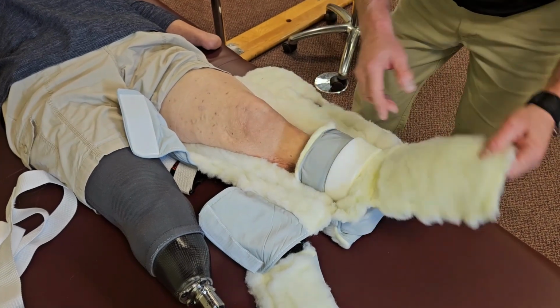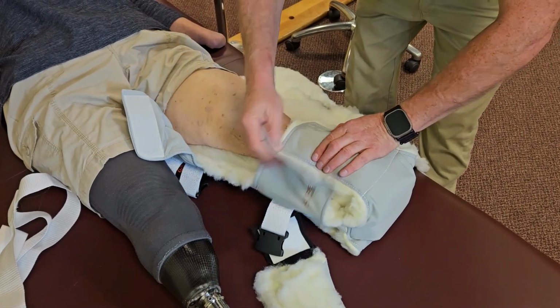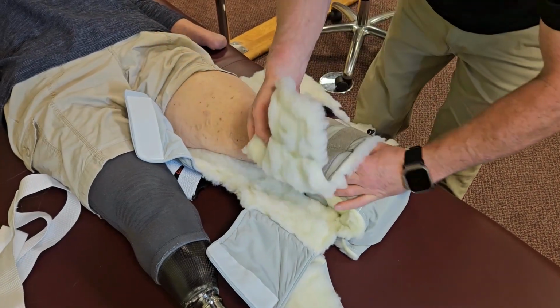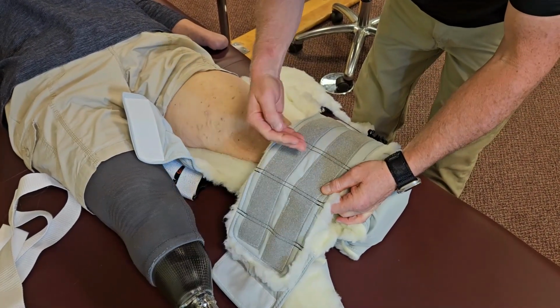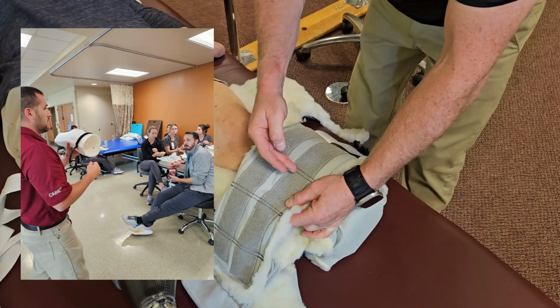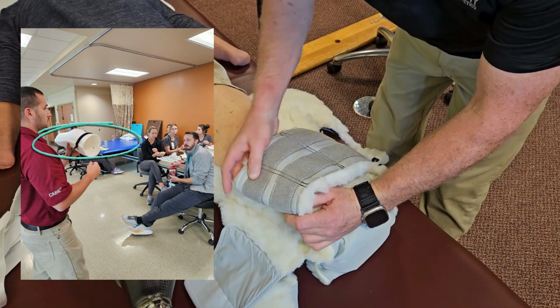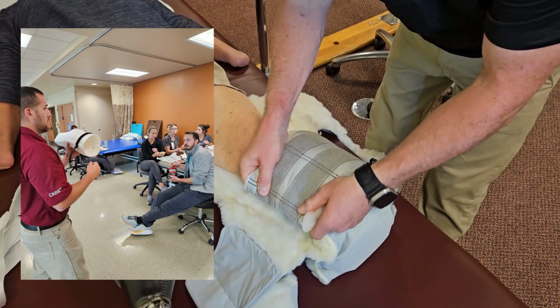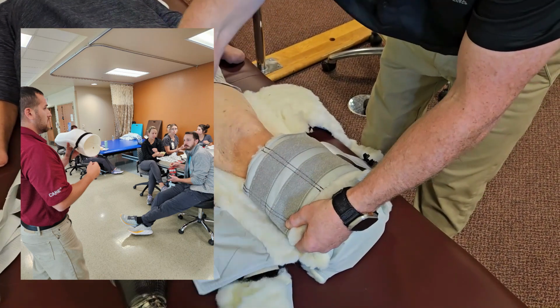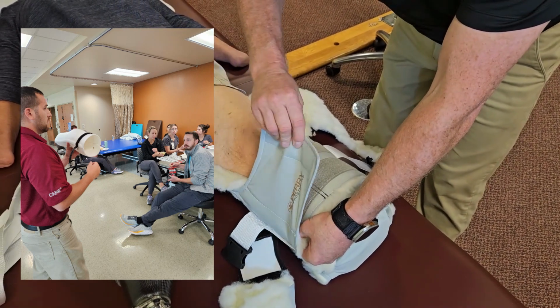If a patient is thought to be a higher risk than average, we do what's called an RRD, which is our rigid removable dressing. But that is a clamshell device that's custom fabricated over their limb. We turn those around in 24 hours. Some of our surgeons make that judgment call right from the beginning, and they get ordered right away. And then we go out and do the education on that.